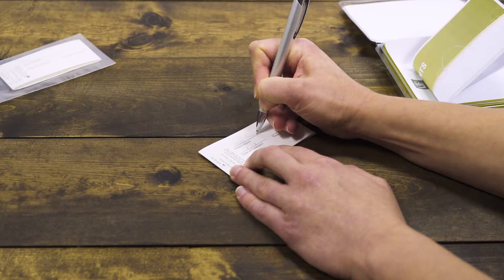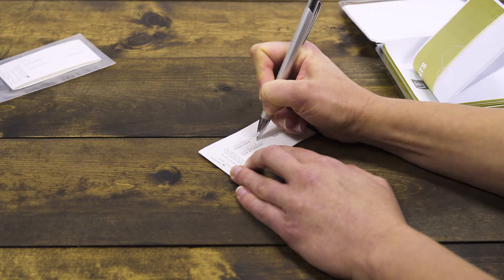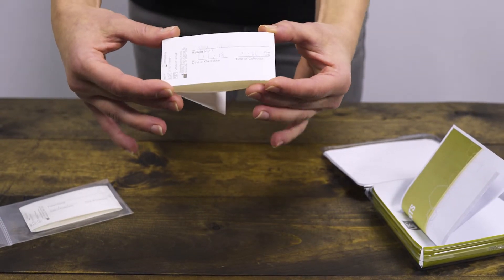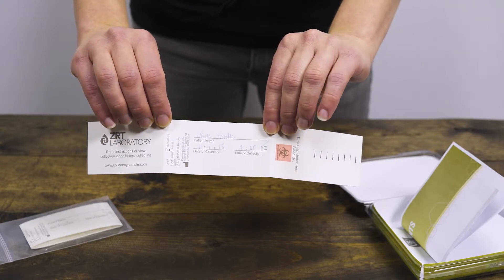Print your name, date, and time of collection on the urine collection card with an ink pen. Next, pick up the collection card and fold the cover back and away from the filter paper. Make sure not to touch the filter paper.